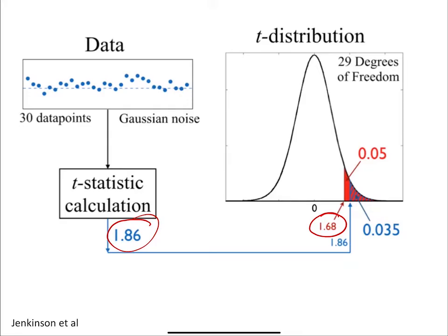Okay. And for many years, people were very happy with the voxel-wise level, especially when they did their group analysis. And even today, if you're just looking at your data and you want to get a sense of whether there's activation, it's fine to do a threshold of 0.05. But when we talk about group analysis, we're going to see how in the last few years, the field has really moved away from 0.05 thresholding for rigorous work. So if you're going to publish your work at the group level, you're going to have thresholds down at 0.01 to be convincing. Otherwise, 5 years ago, you could have published your paper. Today, you probably can't publish that same paper. Okay?